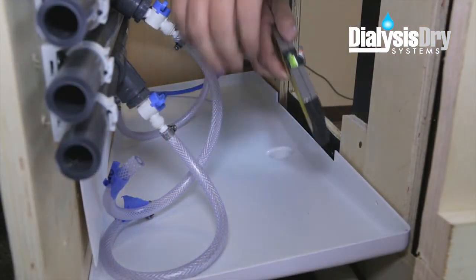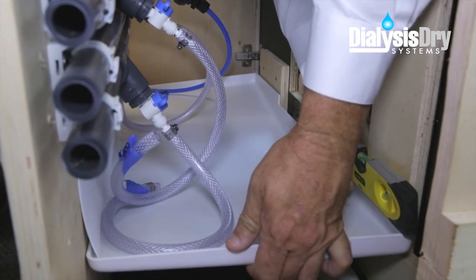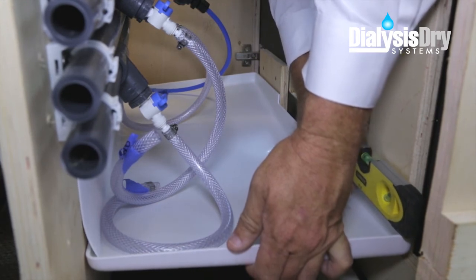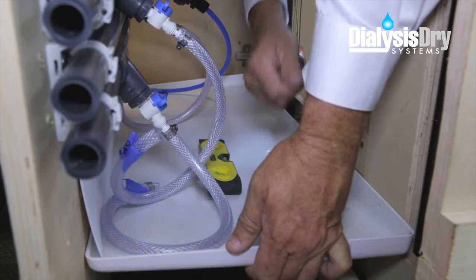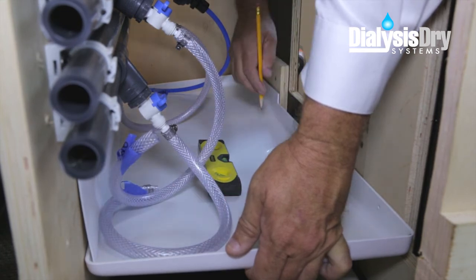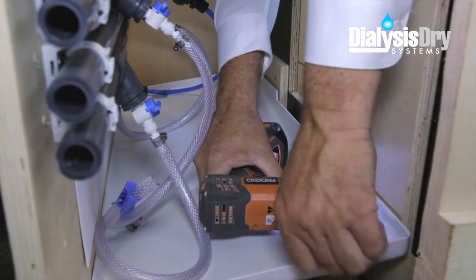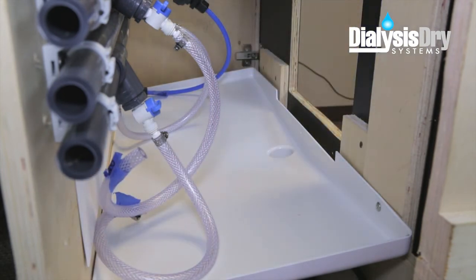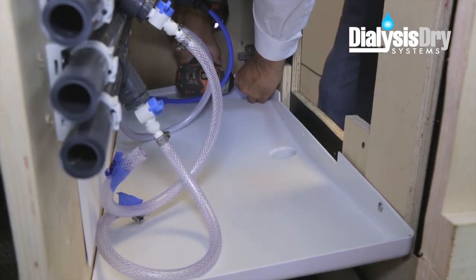Now it's time to attach the tray into position. First, check to make sure the top edges of the tray are level, and the tray drainage pipe extends down into the existing drain pipe one inch, with at least a one-quarter inch clearance between the bottom of the tray and the top of the existing drain pipe. With the tray in the correct position, mark the center location of the tray's pre-drilled holes on the front wall of the cabinet. After that, take each of the self-starting screws and, with a screw gun, drill the screws into the center of the marked locations on the cabinet wall.